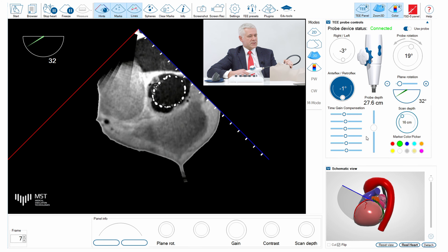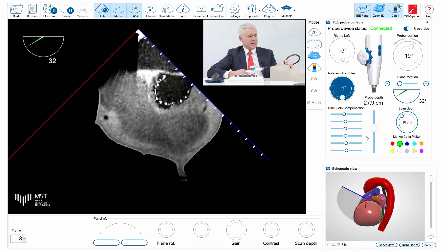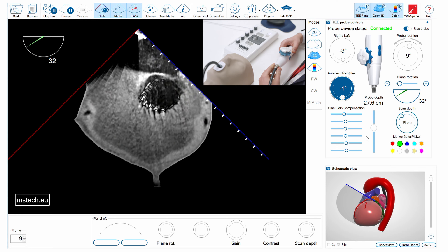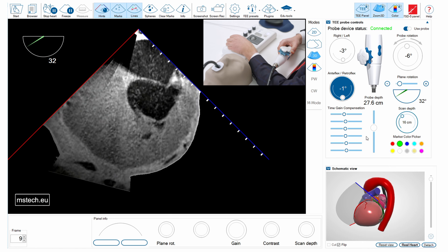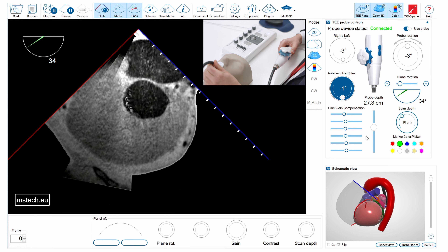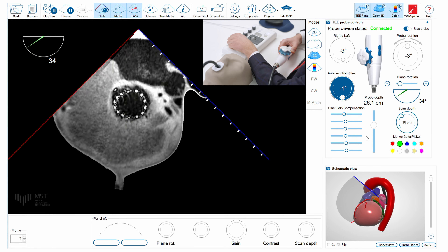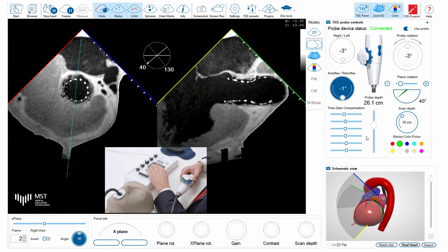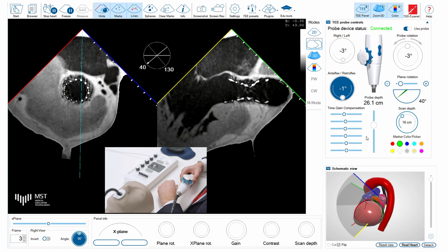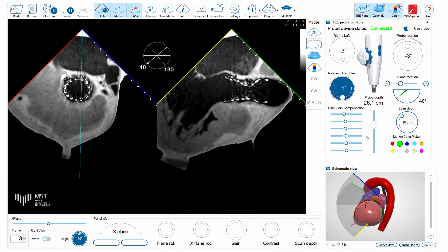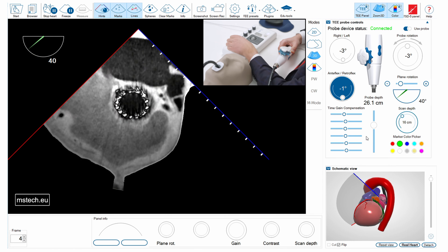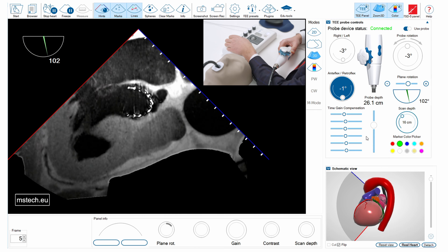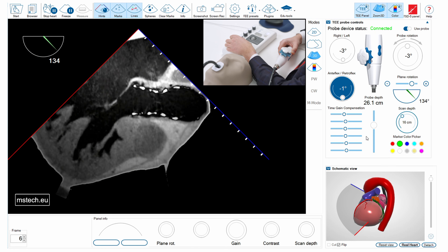Now we can see the stent very nicely. If I put the stent in the center of the image, I have to adjust a bit the depth and also the angle. I can use the X-Plane mode to see the long axis of the stent, or I can increase the angle by 90 degrees — so I'm going to use 130 degrees angle to see the long axis of the valve.